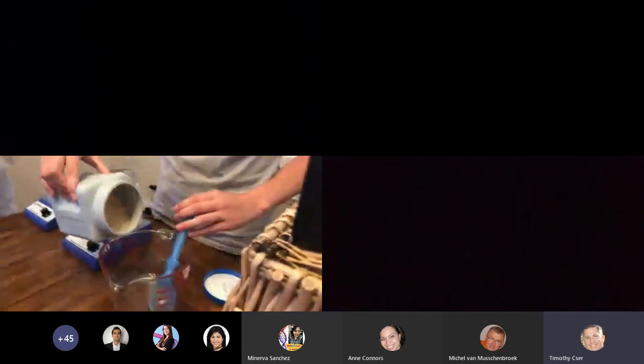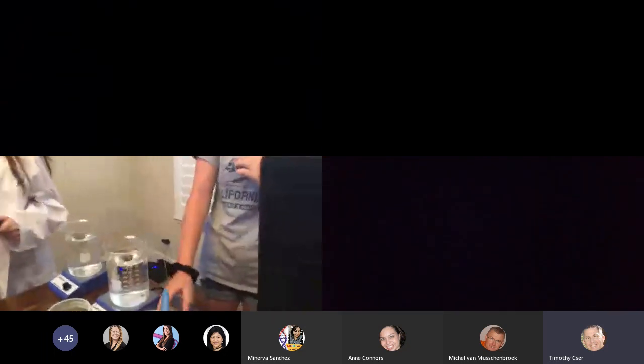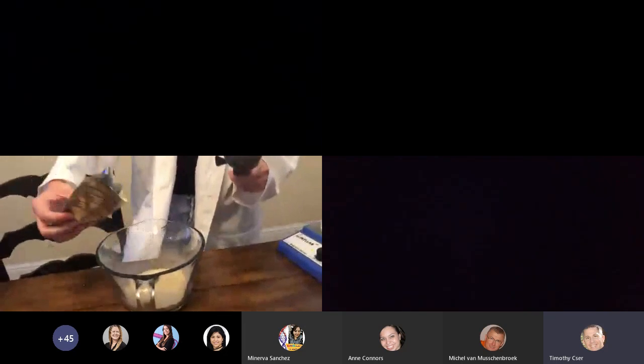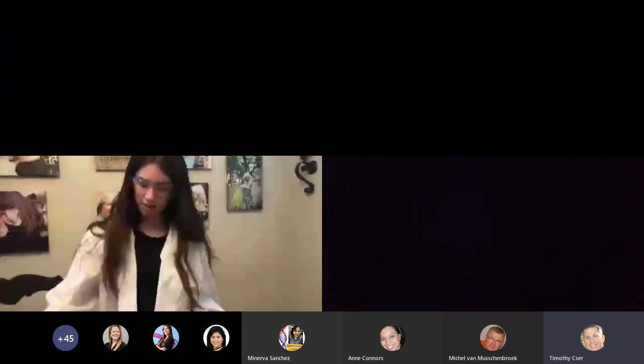She is going to pour some media here into this jar. Go ahead, pour. Whoa, that is a lot of dust. Look at all that dust. Man, that's going to get in my nose. Okay, Emily, you have some granulated media here in our ready bag format. Why don't you go ahead and pour that into the bag jar? That's a lot less dust.